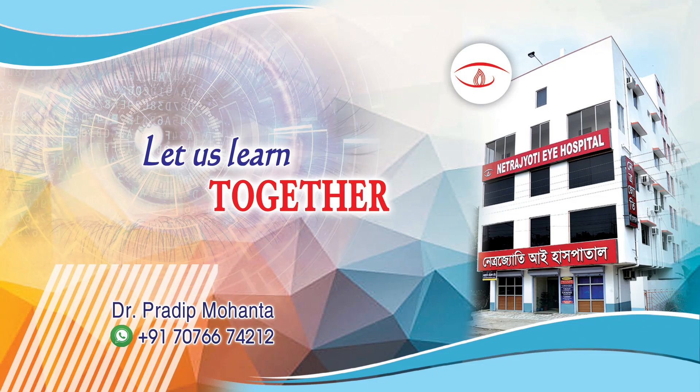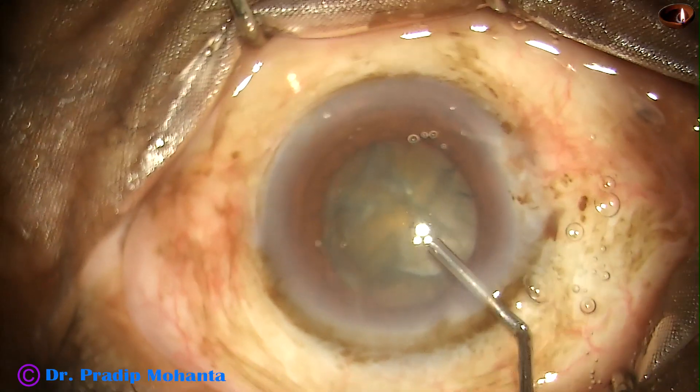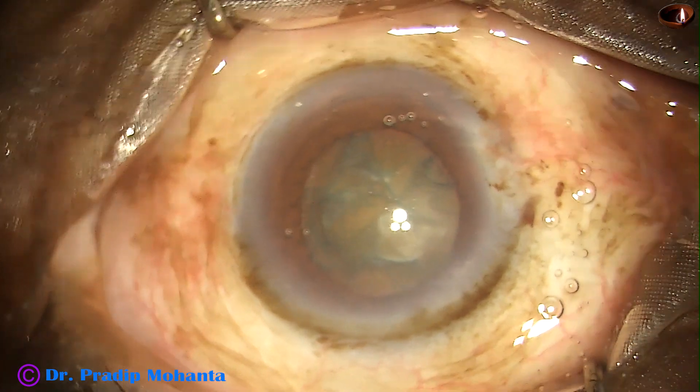Friends, welcome to my workplace at Ranaghat, West Bengal, India. This is a cataract with grade 3 plus nuclear sclerosis. The patient is a very old man, more than 80 years old.